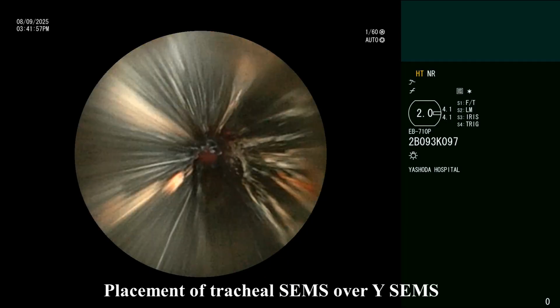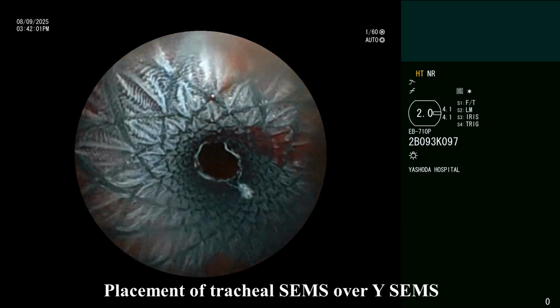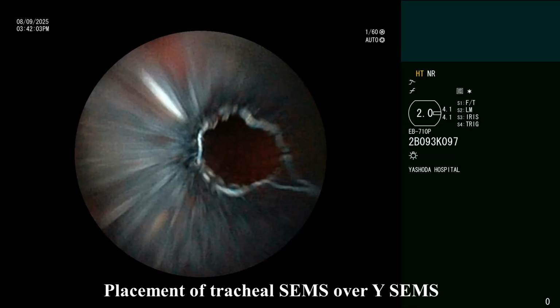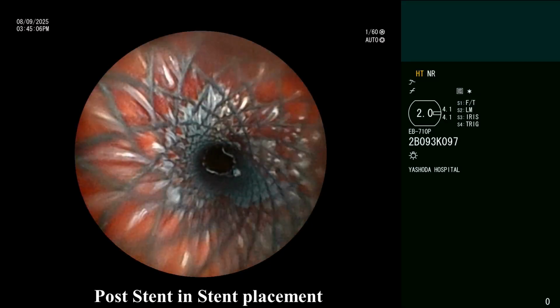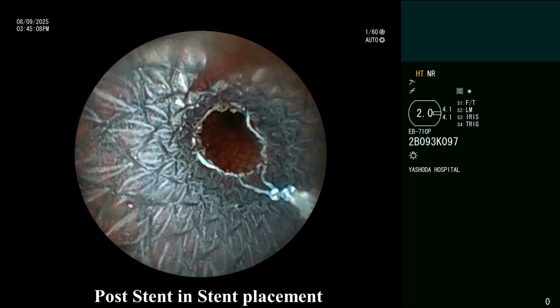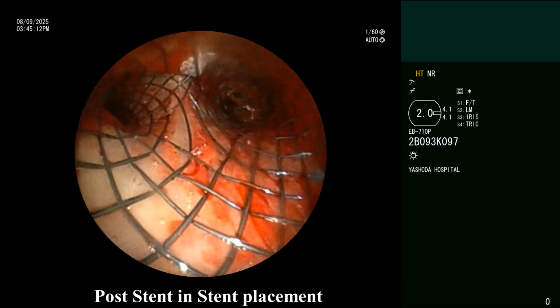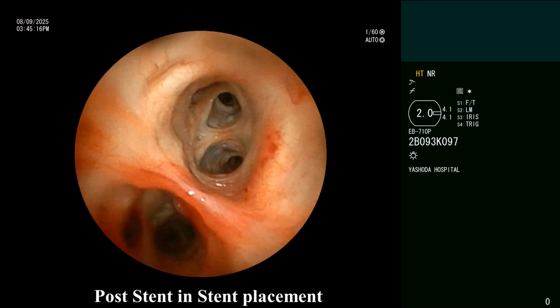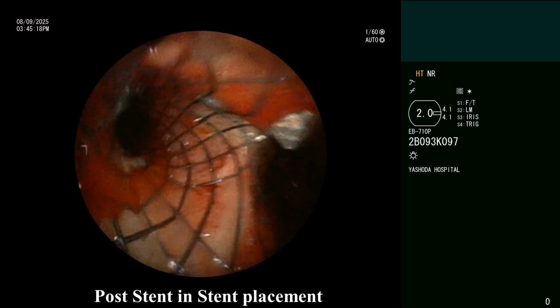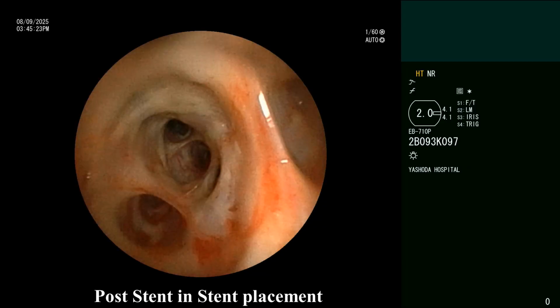And as you can see from here, this has to be done meticulously to get the perfect precision of the deployment of the straight self-expanding metallic stent. And once it is done, now you can see that there is a complete recanalization of the airway, and we have given enough margin above the level of the critical airway obstruction to prevent stent migration, and a stent in stent is placed with a self-expanding metallic Y stent below and a straight self-expanding metallic stent above.